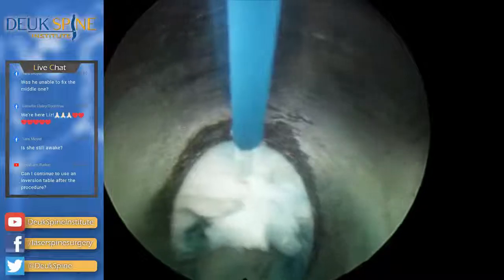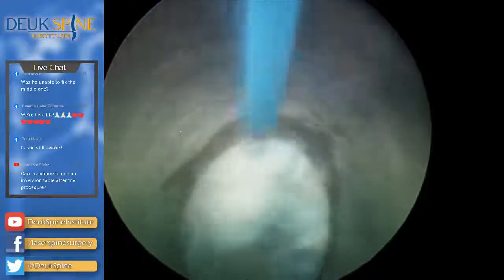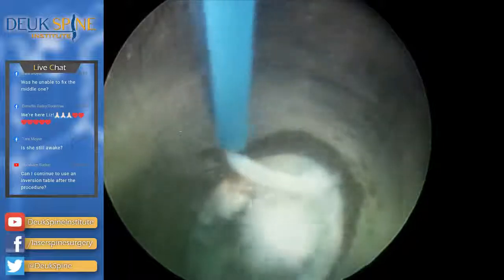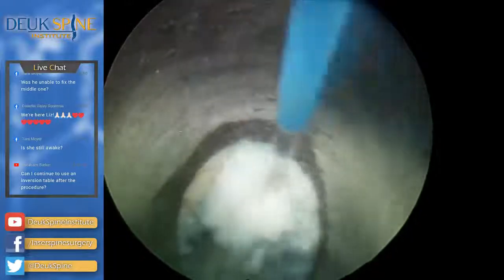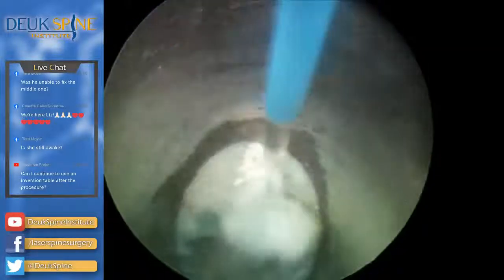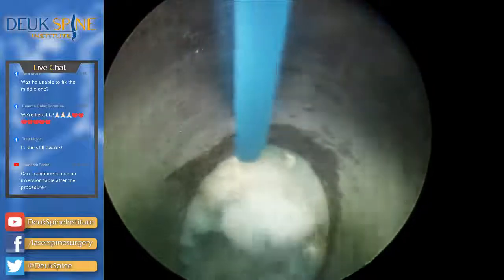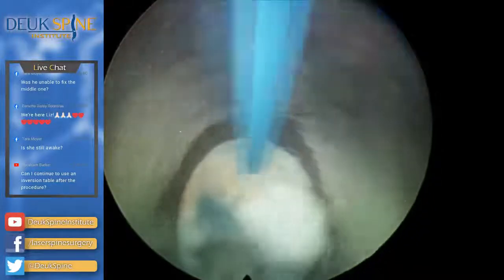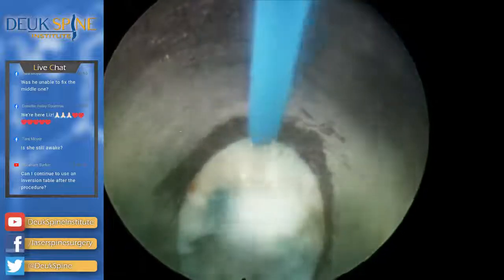Here's the tear. A little bit of collagenization. We're seeing the annular debridement, or part of it. The laser is the little glass pipe at 12 o'clock. The blue is the plastic covering over the glass pipe. It's part of what we call the laser fiber.